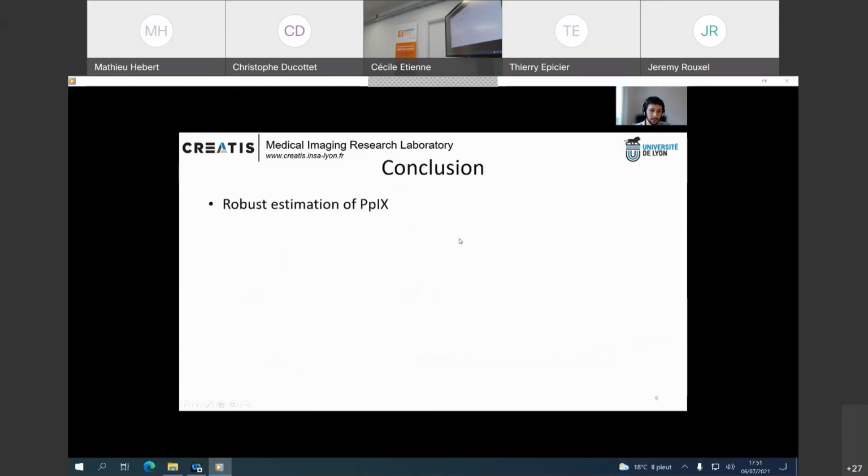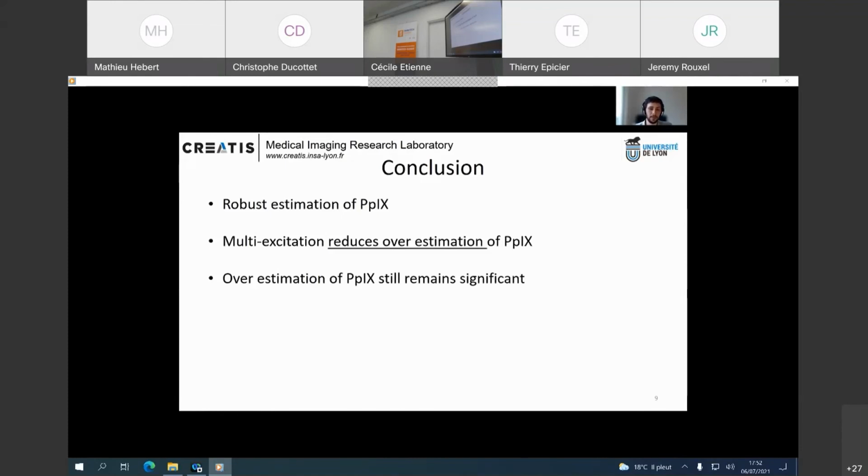To put it in a nutshell, in the context of glioma resection surgery, the 5-ALA-induced PpIX fluorescence spectroscopy is widely used since almost 20 years. To overcome a lack of sensitivity between low density margin and healthy tissues in a mono-excitation wavelength approach, there is a need to have a robust estimation of PpIX inside fluorescence spectroscopy measurements. We suggest a new approach based on multi-excitation linked by solutions based on the absorption spectra of interest fluorophores.